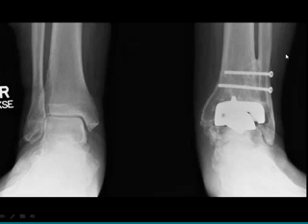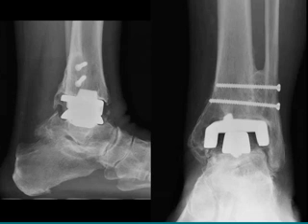But if you look, and I'm going to use my cursor here, you can see this large cyst on the medial side, okay? And then there's another cyst down here in the medial side of the talus. The orientation of the prosthesis on the AP view doesn't look too bad.